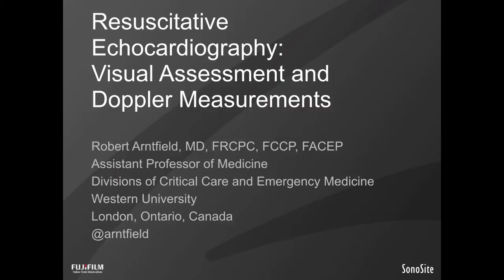And so this tutorial or webinar is designed to try to bridge that gap that I think currently exists in a lot of the education out there and to highlight for you some examples where this may be helpful. So this webinar entitled Resuscitative Echo, Visual Assessment and Doppler Measurements is going to be a wandering tour through both the visual approach and the quantitative approach to left ventricular function for the most part.